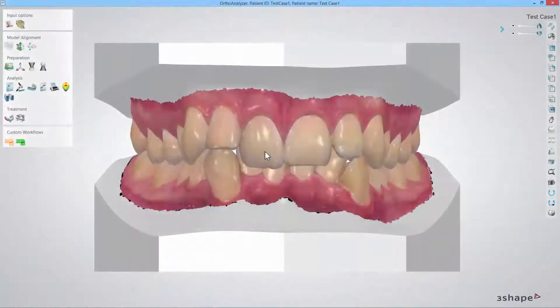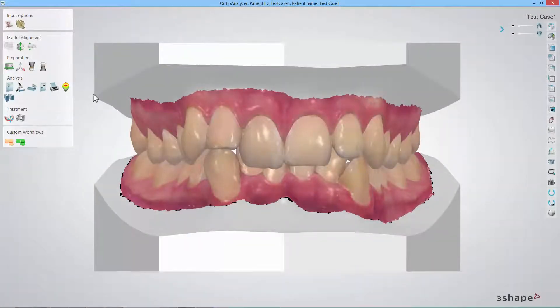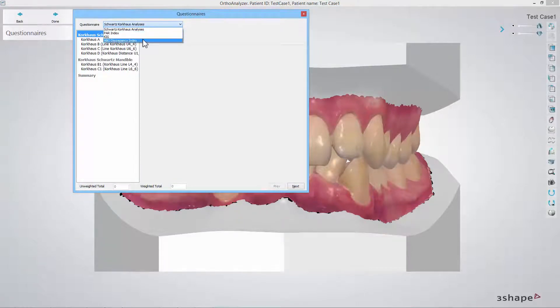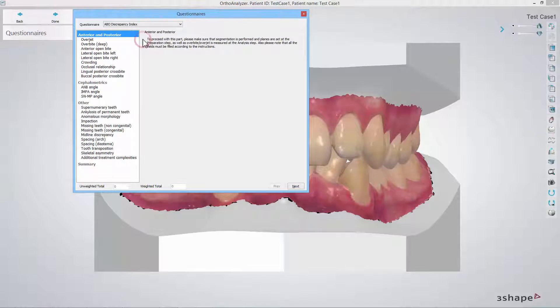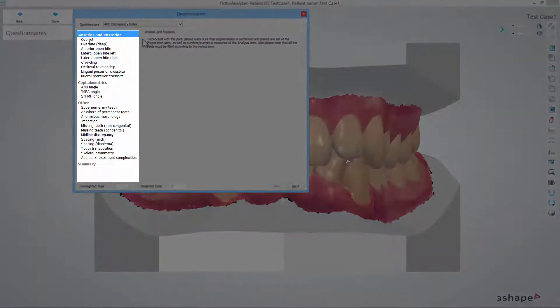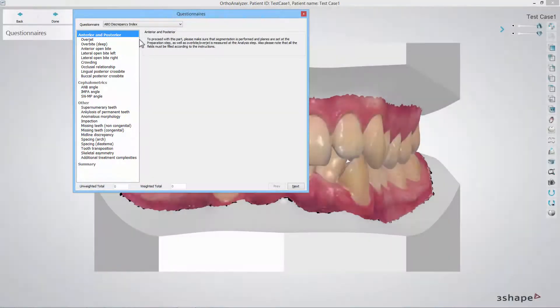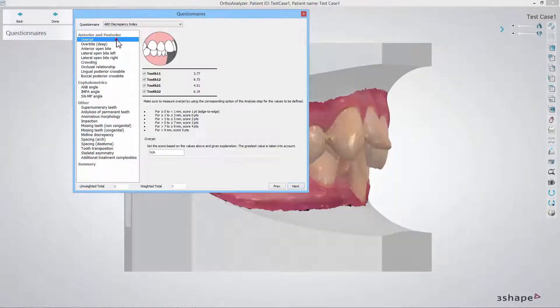Once in OrthoAnalyser select questionnaire from the analysis section. In the pop-up window select the ABO Discrepancy Index option from the drop-down list. You will notice that the scoring system steps appear on the left and you are able to click the specific step to go to it.